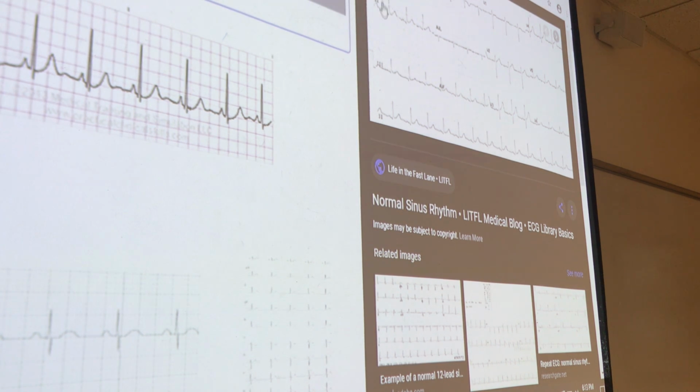Now what else? We can also measure how high these QRS waves deflect up. We have a chart that tells us, this is healthy, and this is really bad, if it's really low or really, really high. Or we can measure it when the ST segments are very prolonged. What do I mean by this? Notice you have a QRS, and then it comes back down, and then you have a T wave. QRS comes back down to baseline, and then a T wave. That's what we want to see. A QRS that goes up and down, goes back to baseline, and then a T wave.